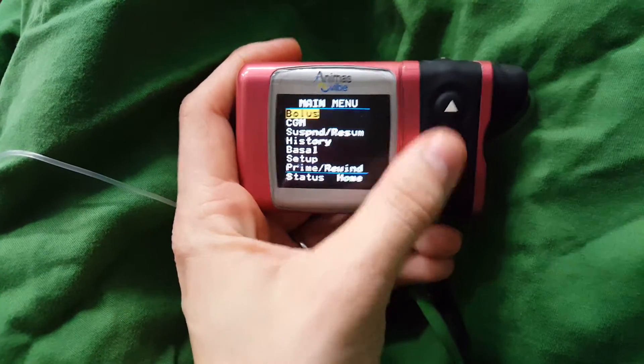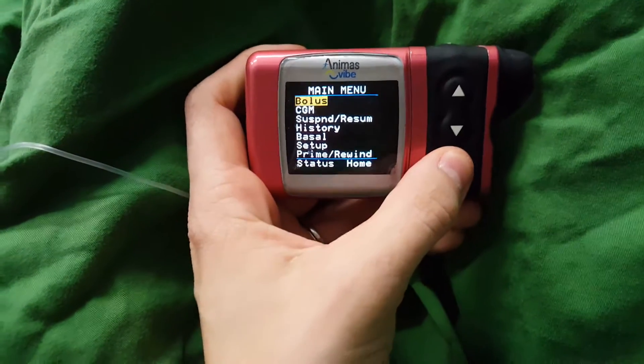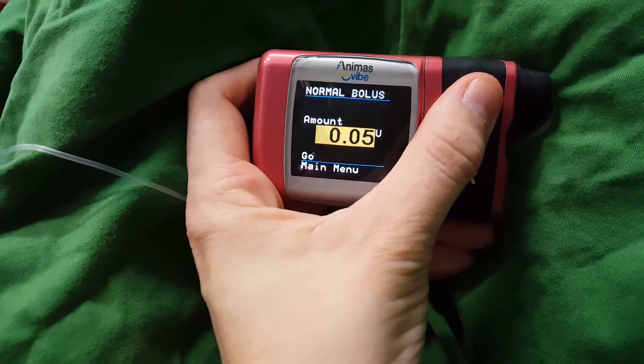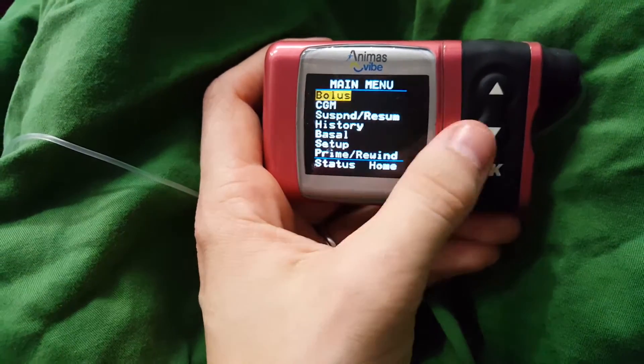So this is the menu. You can see there's lots of different things here. We'll go to the top, start at the beginning — good place to start. Bolus. So there's a couple of different boluses you can do. There's a normal where you can go anything from 0.05 of a unit up, depending on if you just want to give yourself a standard level of insulin.